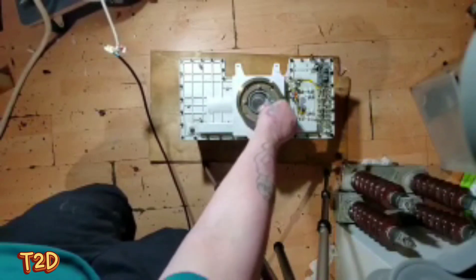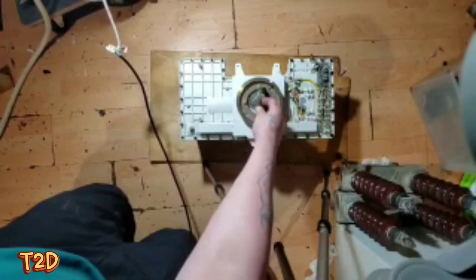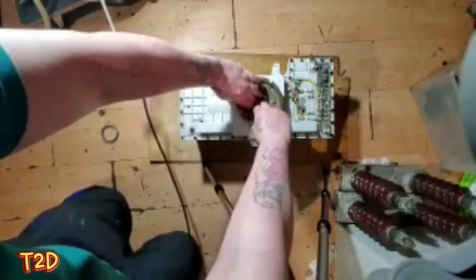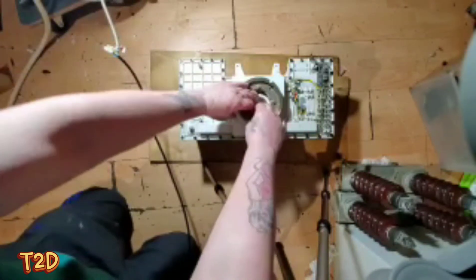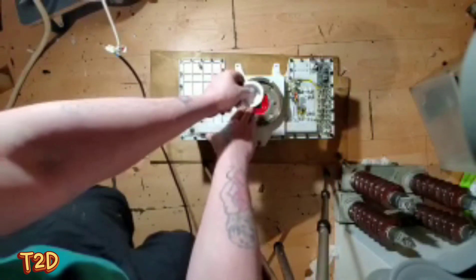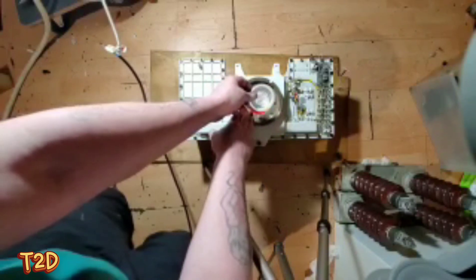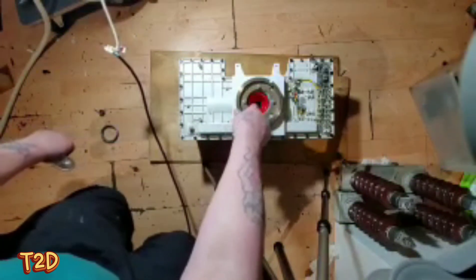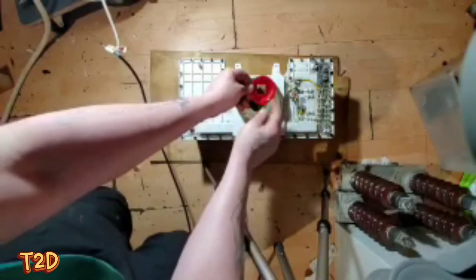As we start to disassemble, the first thing we notice is a lead ring with threads, so we can remove that. Then we have some aluminium cups, and the purpose of these is to cut down the soft x-rays - to reduce the dose to the patient, they put aluminium filters in here, which cuts out all the soft stuff and only lets through the high-energy stuff.